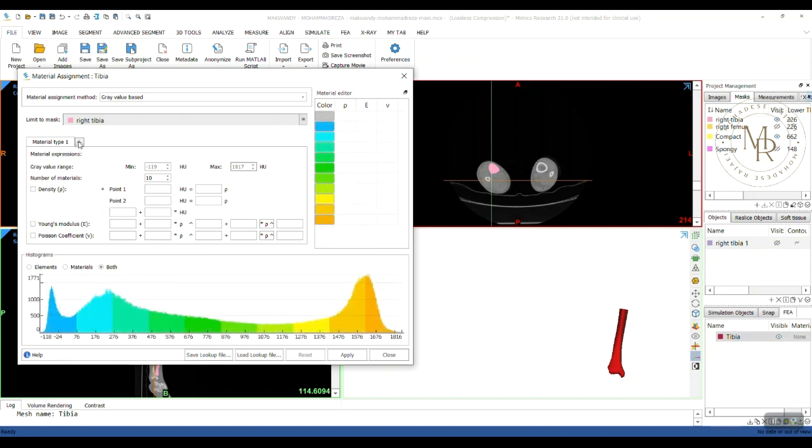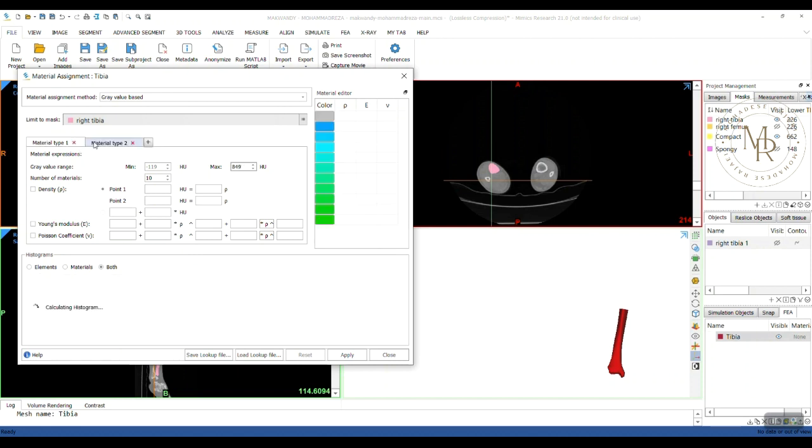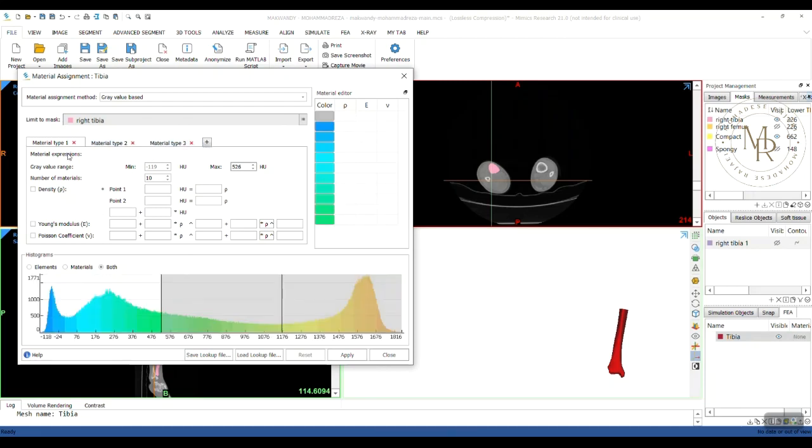So, by clicking on the plus, you can add three materials. Alright, for the first material, as you can see, the grayscale values are least. So, it must be the fat layer.